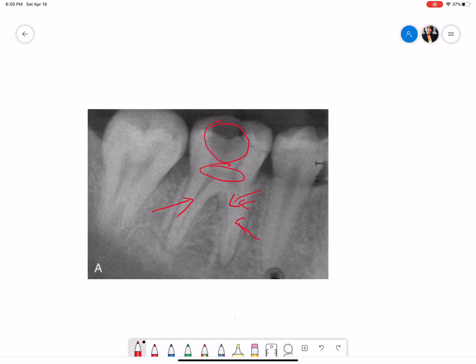The periodontal ligament space with both the roots is widened in the apical one-thirds. The lamina dura is continuous with both the roots, and the peri-radicular area especially with the distal root shows some amount of radiopacity, which is again a sign of sclerosis.